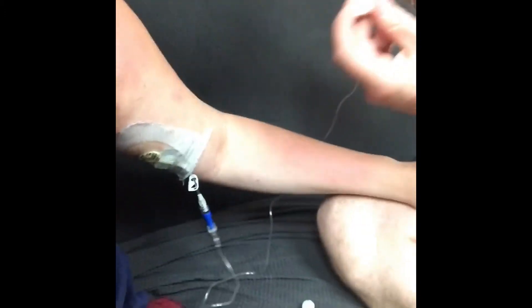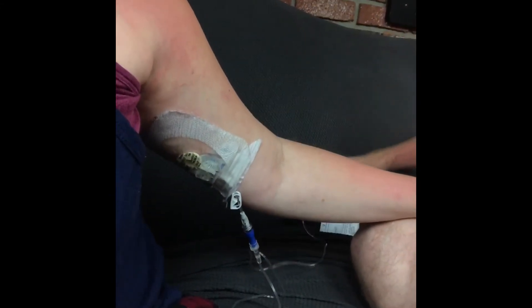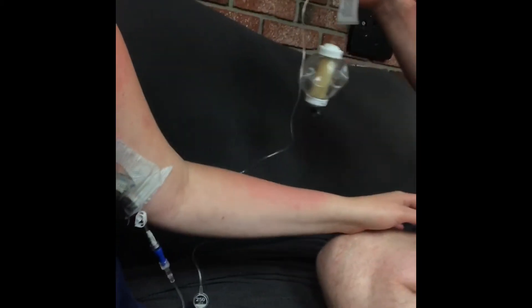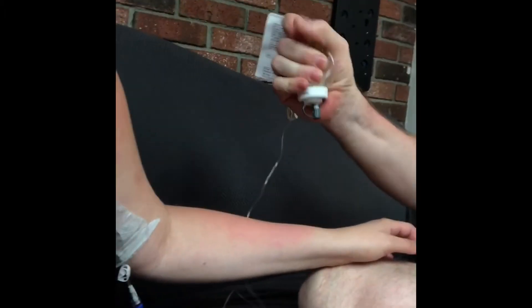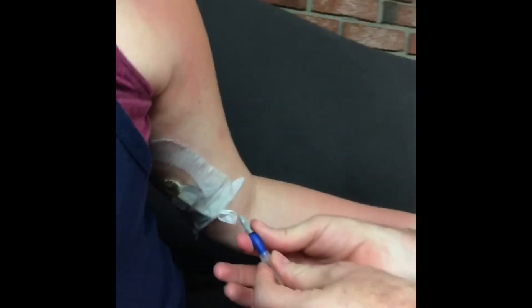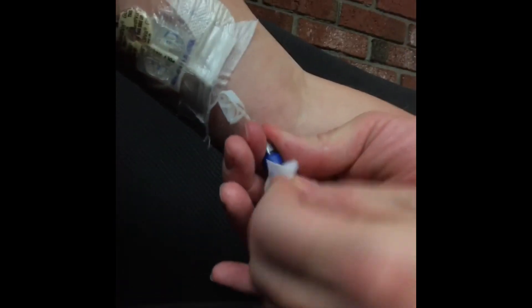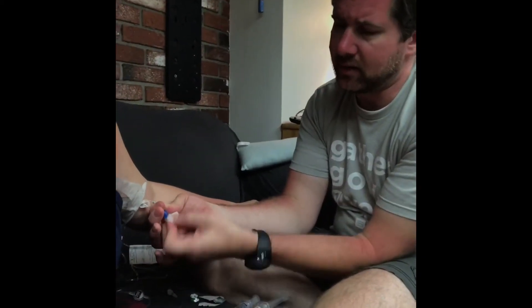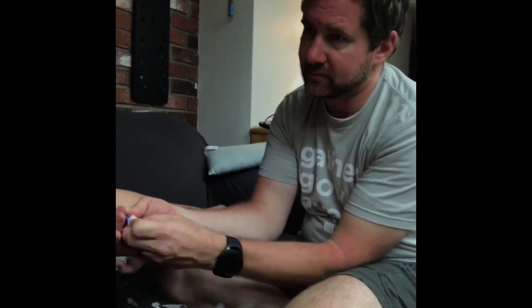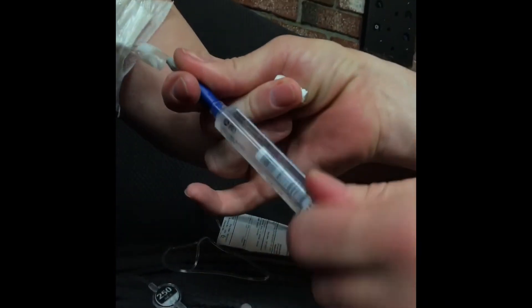Clamp off the vancomycin so that if there's anything left it doesn't go either way. There it is — that's what it looks like finished: empty, nothing left. Disconnecting — just twist it off. Then 15 seconds of scrubbing with the alcohol pad. Someone once told me in the hospital that if you don't know how to count to 15, you can sing Happy Birthday. Then flushing with the 10cc's of saline.